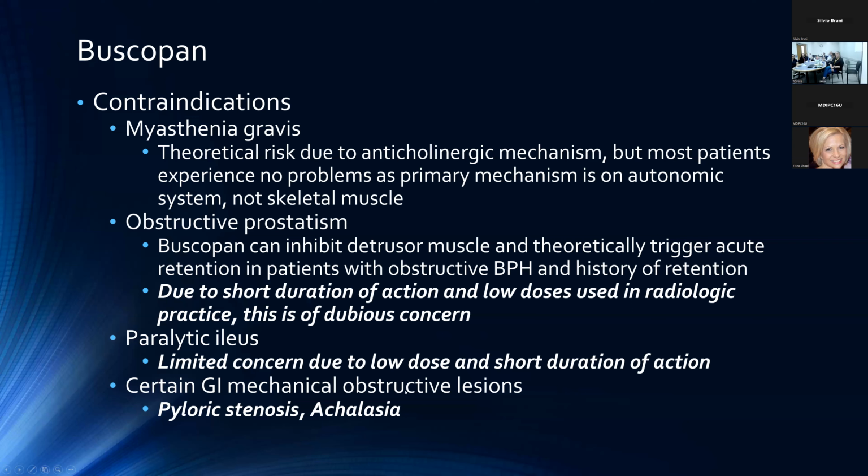And currently we're working on tweaking the standing protocol for this, as well as the screening form, to limit the number of times that we're avoiding giving in that particular context.